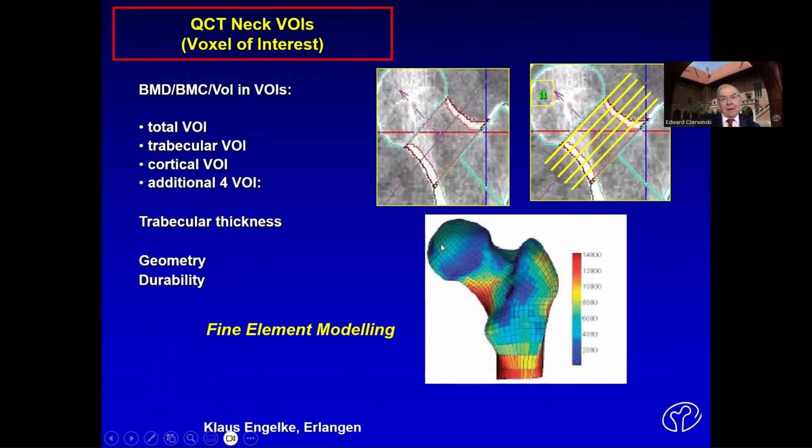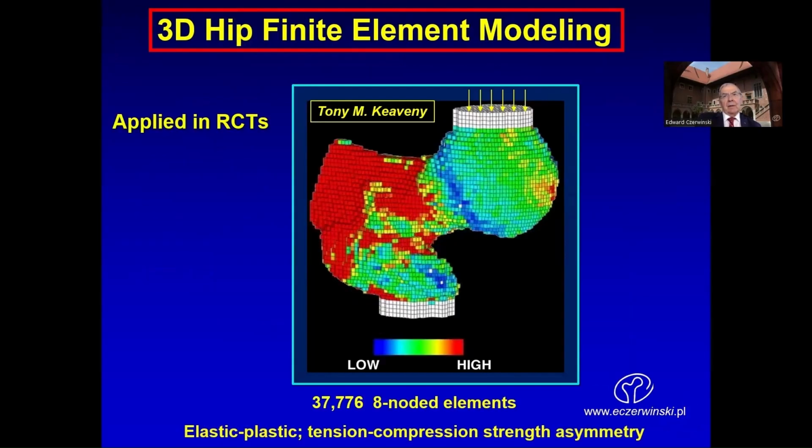And as we know each voxel position, its diameters and its weight, the bone density, we can calculate the bone strength, and you can calculate the resistance of bone to stress.